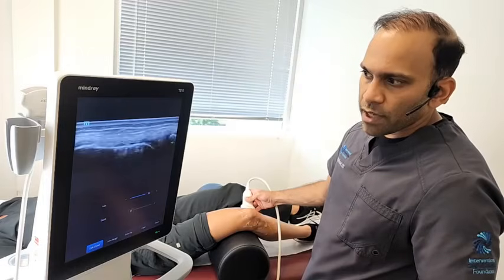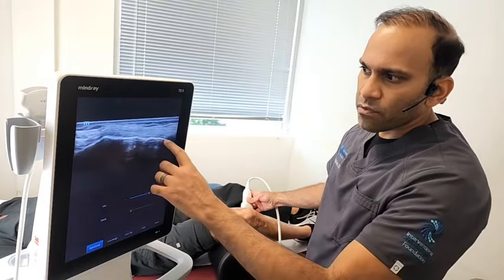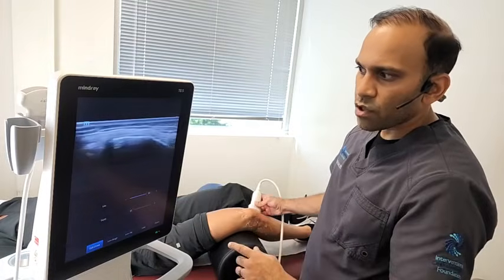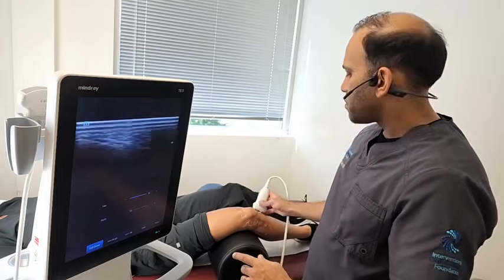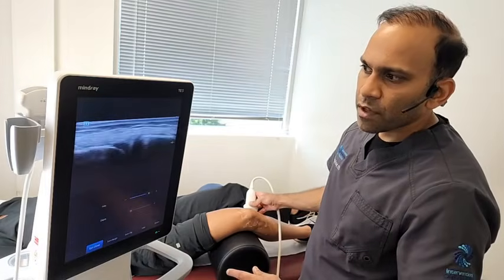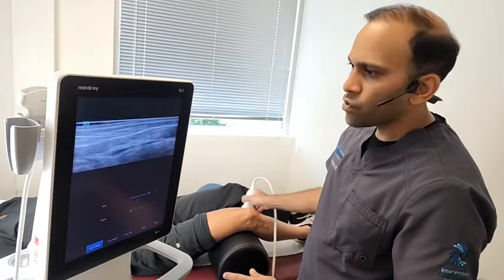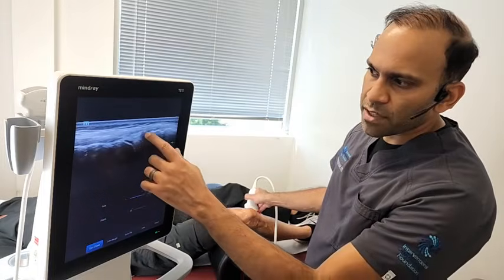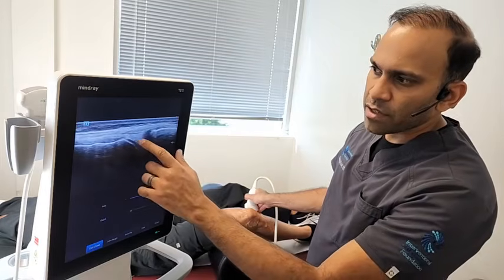So when we look at the inside of the knee here, we're going to see from the thigh bone, the femur, going across the top all the way down to the lower leg is this line that we see called the medial collateral ligament, or the MCL. And this is a line that goes all the way across. Now, in between the thigh bone and the lower leg bone is where we have the medial meniscus. So the thigh bone here, lower leg bone here, and here is the medial meniscus.